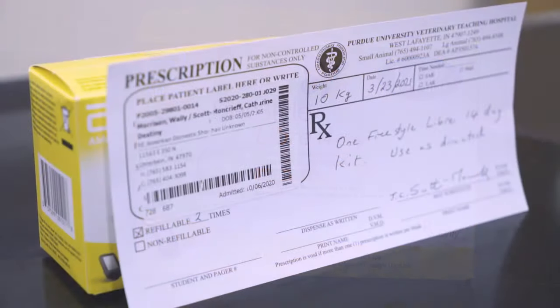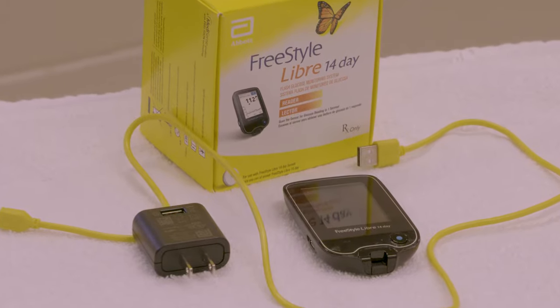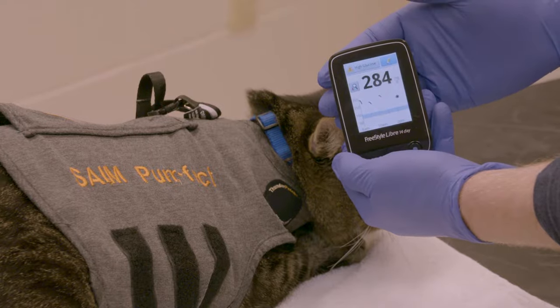The first step is to obtain the Freestyle Libre sensor and reader for your patient. Purchase of the sensor and reader requires a prescription. The sensor is a one-time use disposable device, while the reader is a one-time purchase and can be used multiple times with different sensors. The reader allows wireless monitoring of the interstitial glucose.